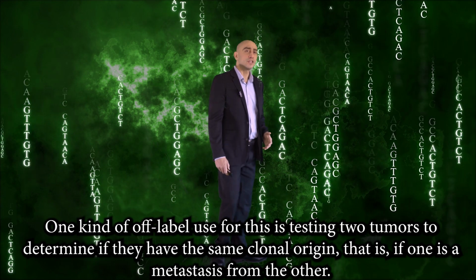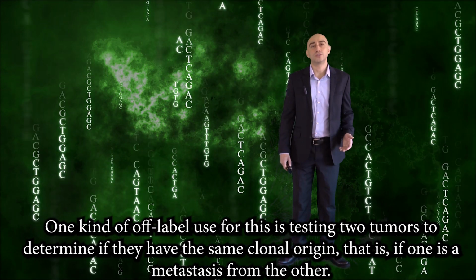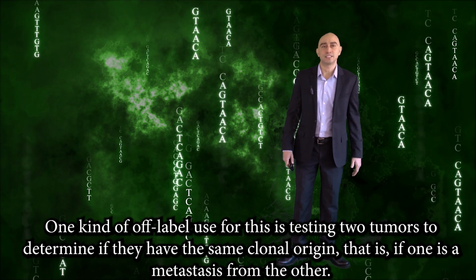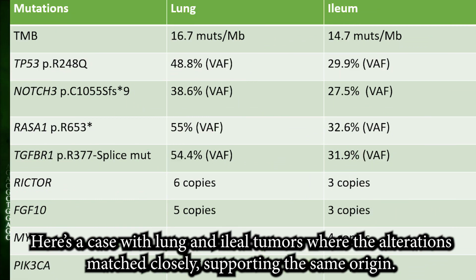One kind of off-label use for this is testing two tumors to determine if they have the same clonal origin, that is, if one is metastasis from the other. Here's a case with lung and ileal tumors where the alterations matched closely, supporting the same origin.